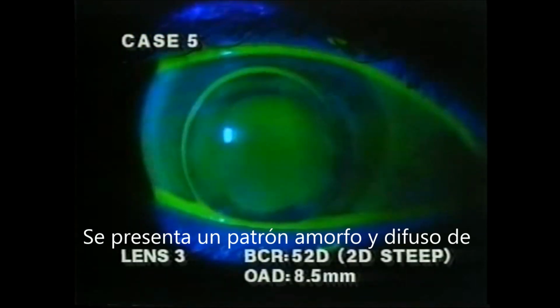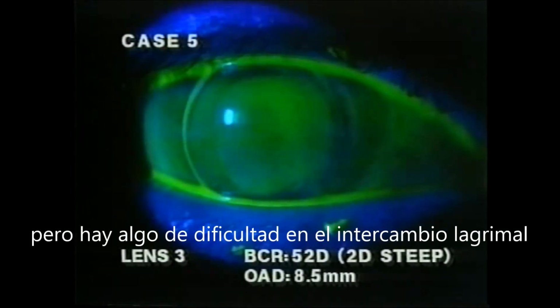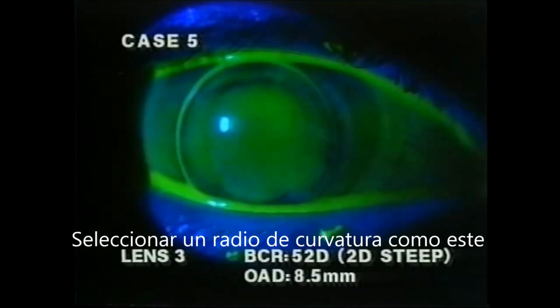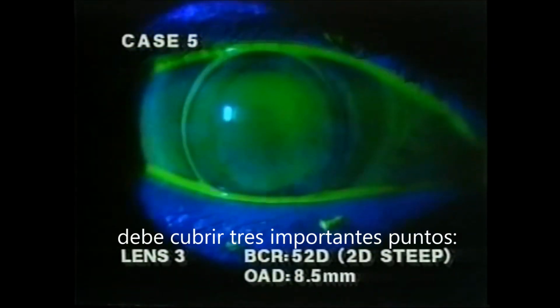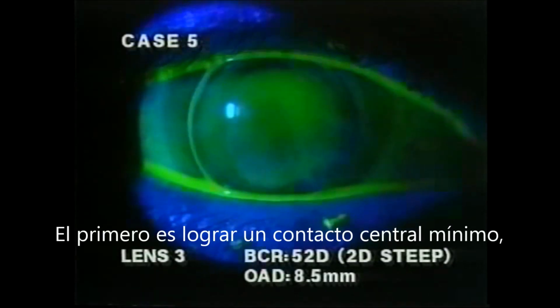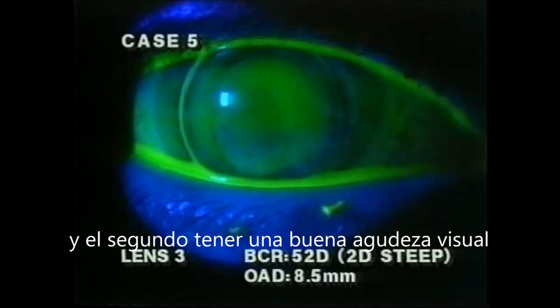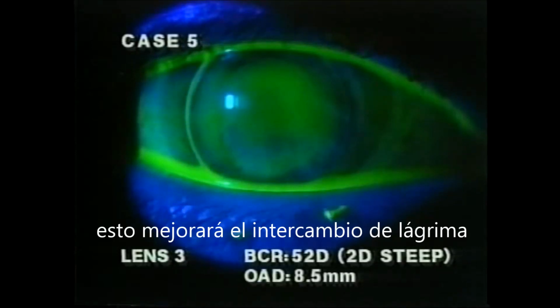A more diffuse fluorescein pattern is present than with the previous examples. The lens centers reasonably well, but peripheral seal-off would possibly limit tear exchange. Selecting a flatter base curve radius would be helpful in providing a three-point touch fitting relationship. This would apply slight pressure to the cone apex and very likely improve the patient's visual acuity. In addition, flattening the peripheral curve radii should reduce the seal-off present in that region.